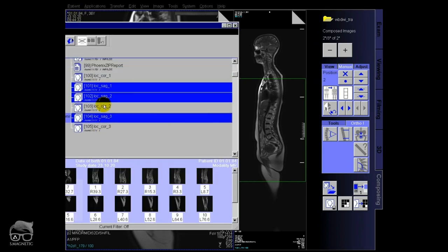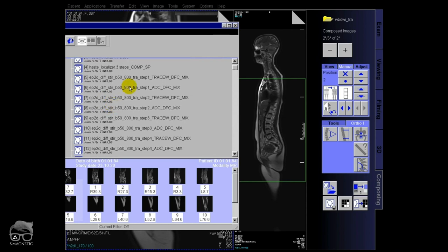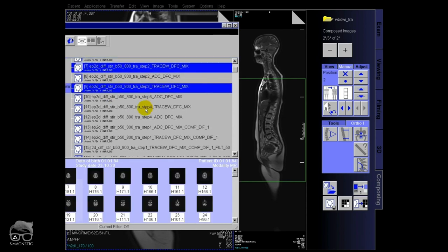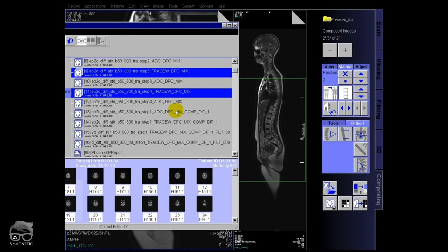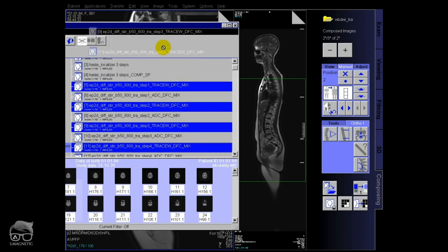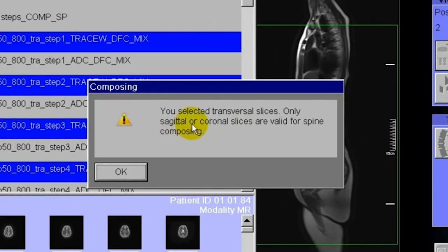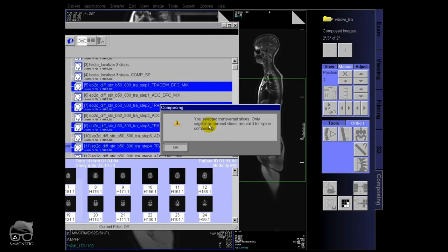Let's try to do the transversal. We're going to drag and drop the transversal b-value trace images from step one to step four — and there you go, it says: 'You selected transversal slices — only sagittal or coronal slices are valid for spine composing.' So transversal doesn't work directly, but we want the whole transversal stack in one so we can do post processing and get a whole overview of the scan. We'll find a workaround.